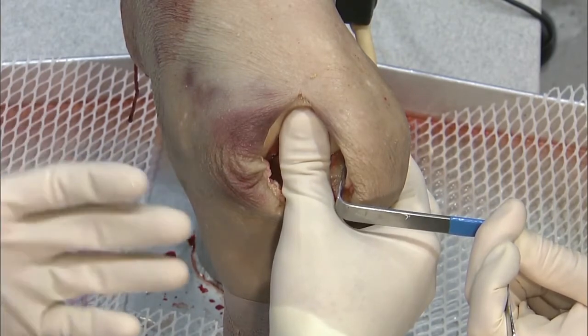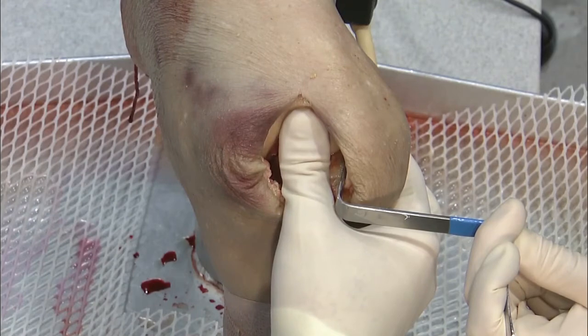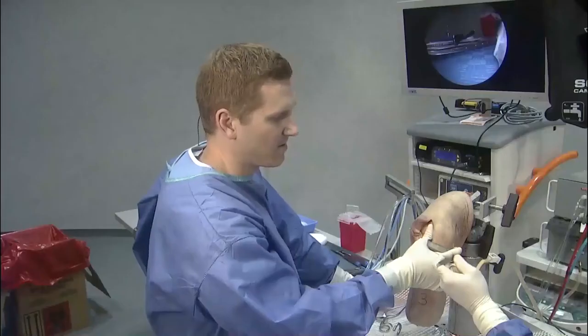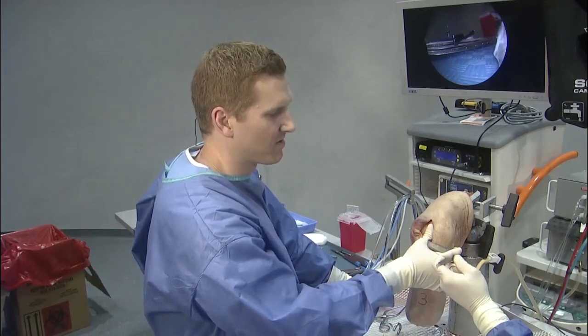But the technique, as you can see, has become so simple. I definitely think it's more reproducible than it used to be with meticulous suturing technique, often checking, is it a watertight seal? The nice thing here is you have guaranteed even distribution of cells within the defect. When you're injecting it, you always saw the fluid and tried to create a chamber and hopefully get even distribution, but I always wondered about that. Here you're guaranteed, again, there's 500,000 cells per square centimeter on this membrane, so I think it's a large advantage.